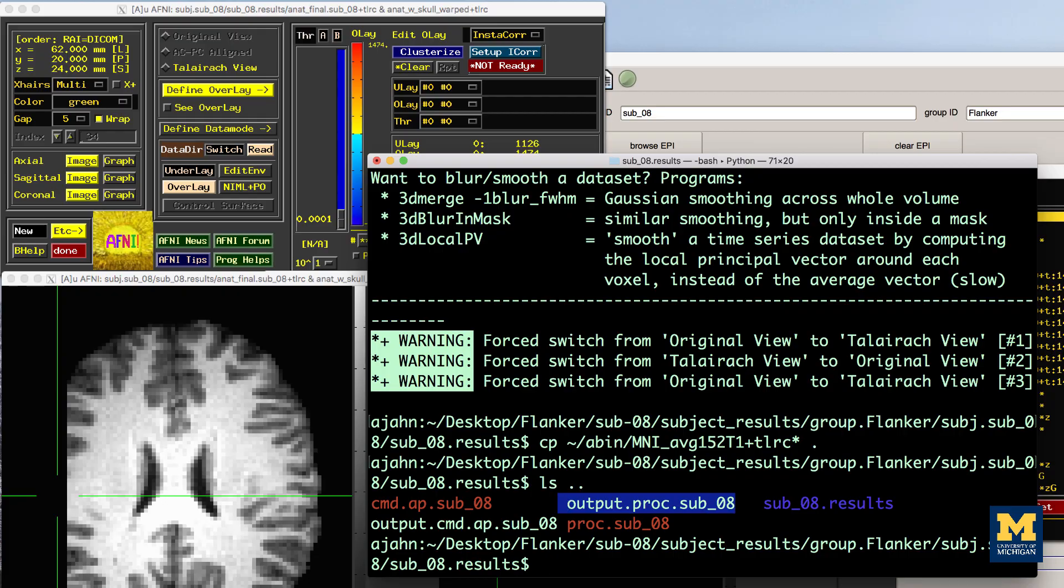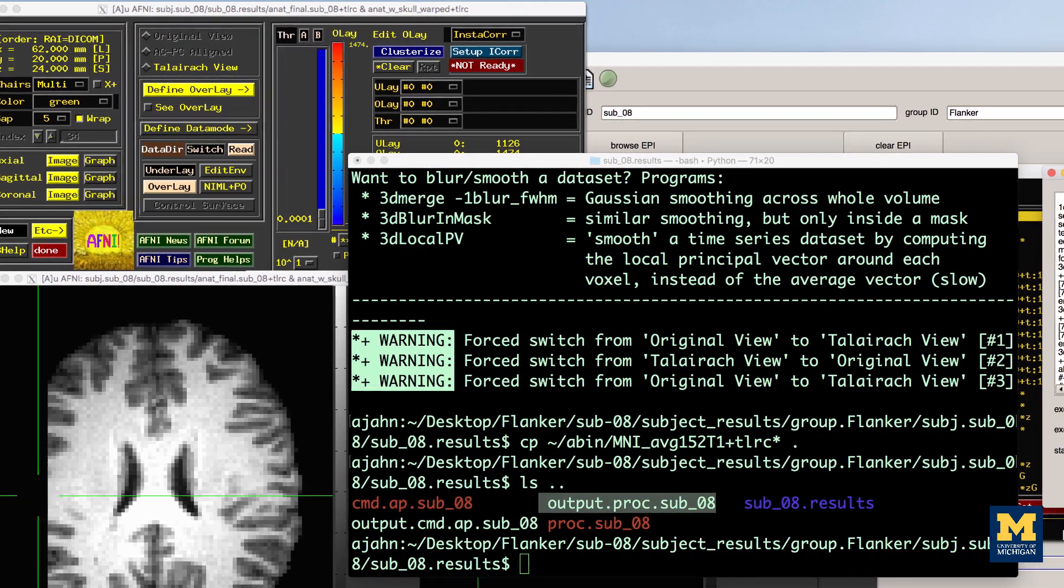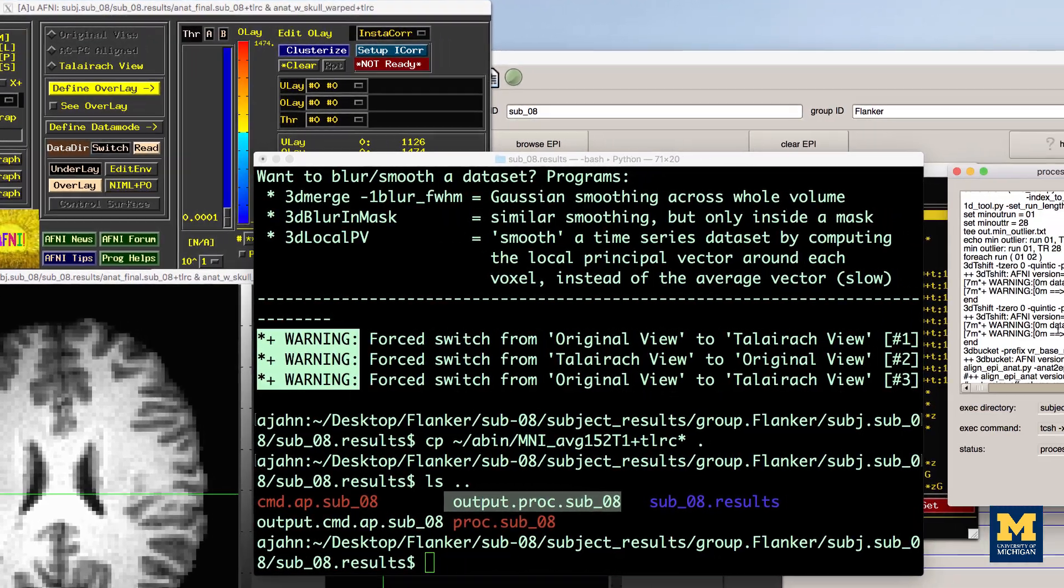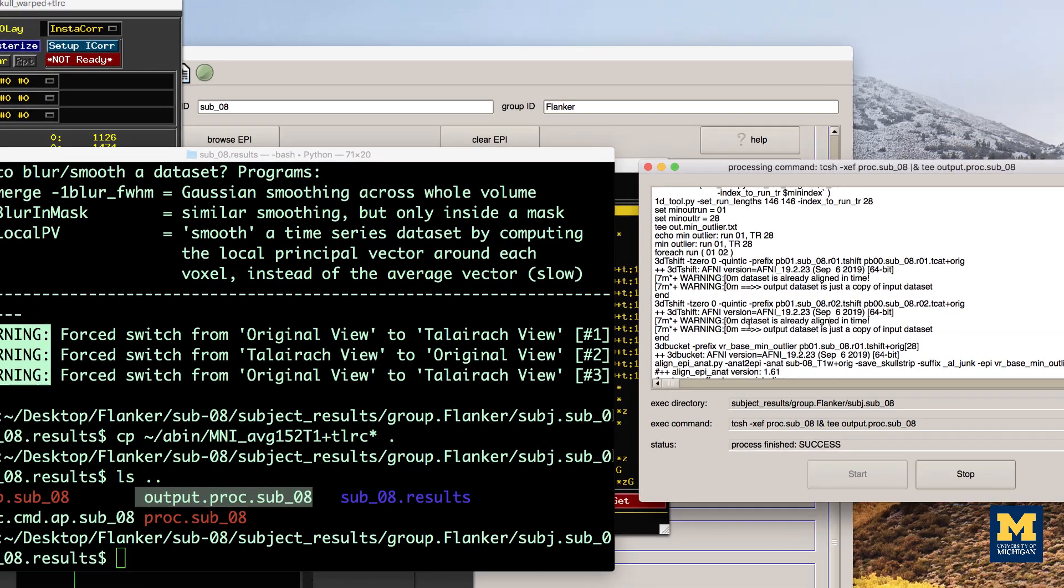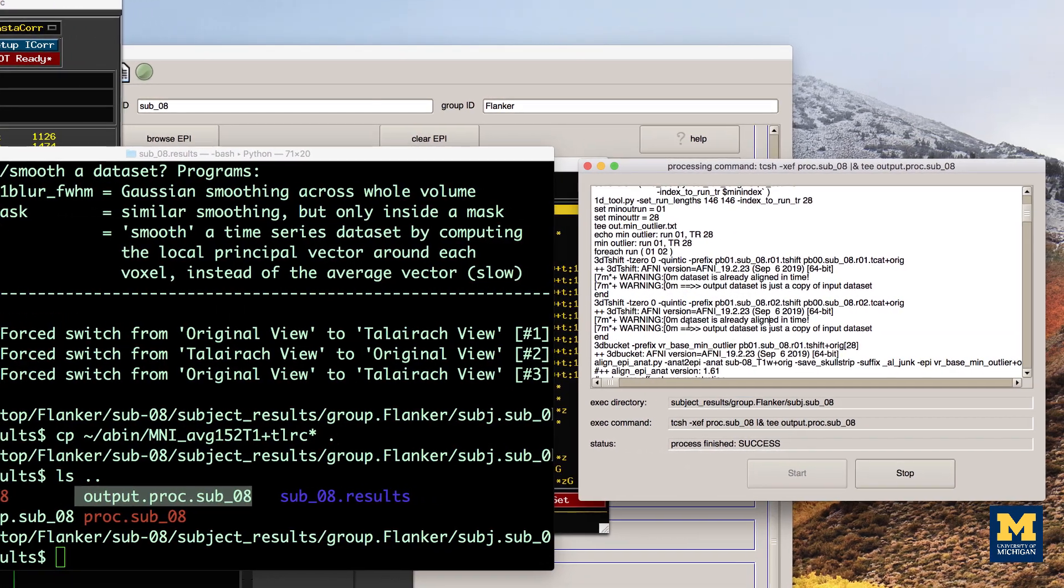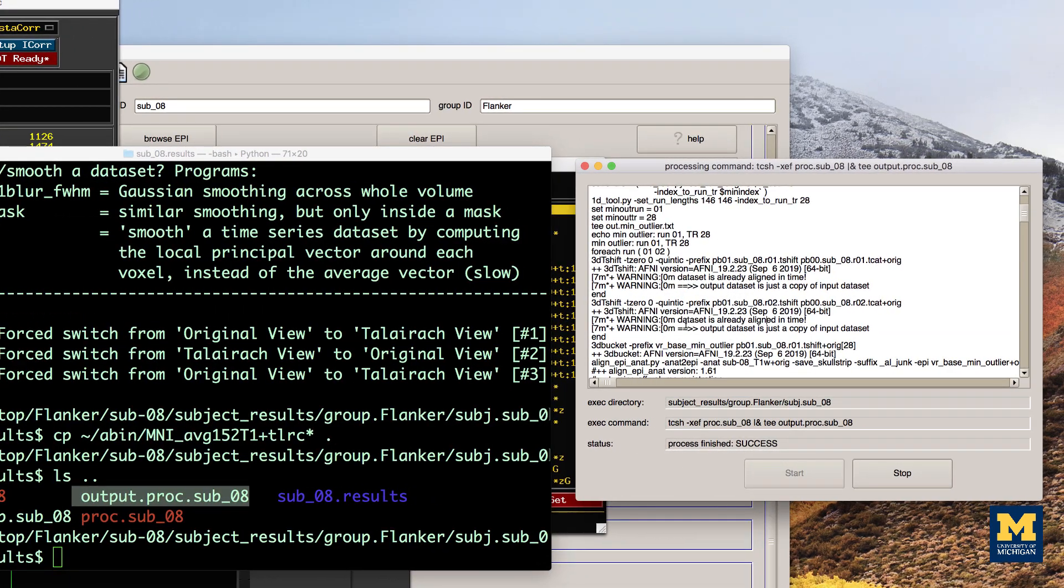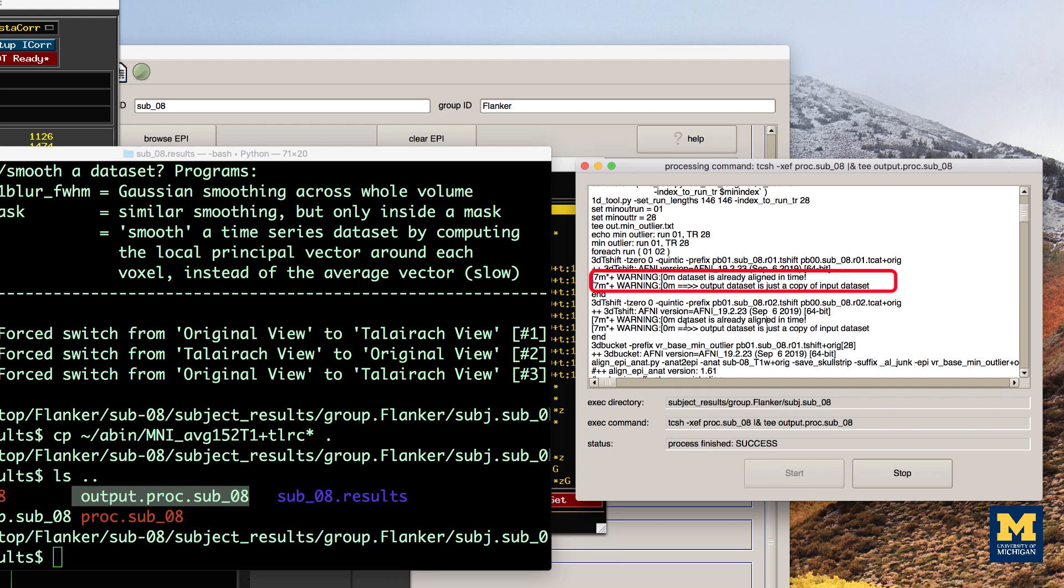This text will contain both warnings and errors. Errors indicate that either a file is missing or that a command was not able to run successfully. Usually the script will exit after an error is encountered. Warnings, on the other hand, point out something that may be a problem. An example of a warning is the dataset already aligned in time notification that we received during slice time correction.